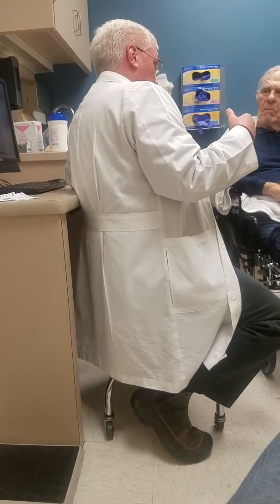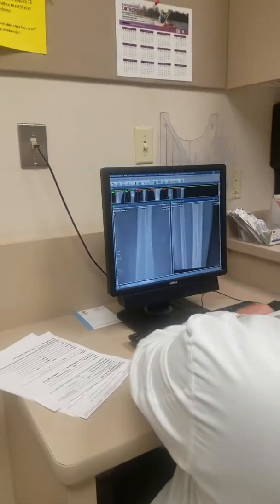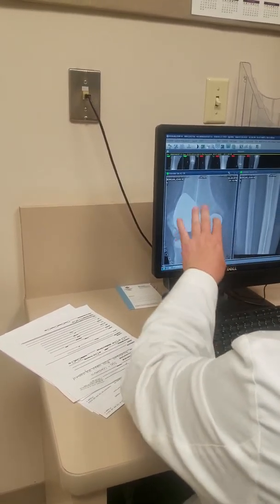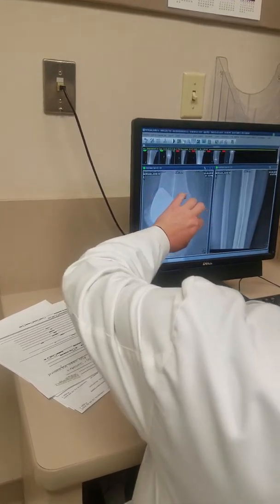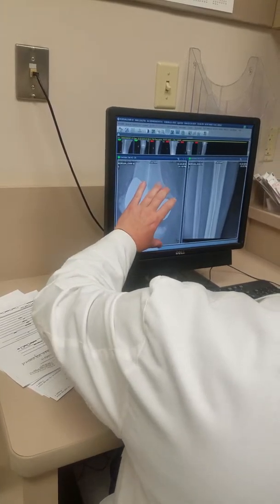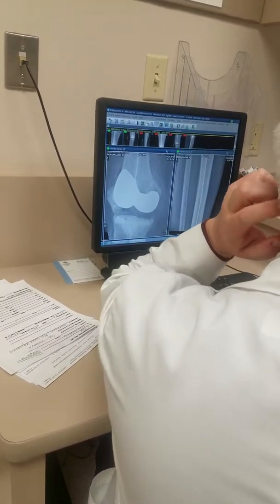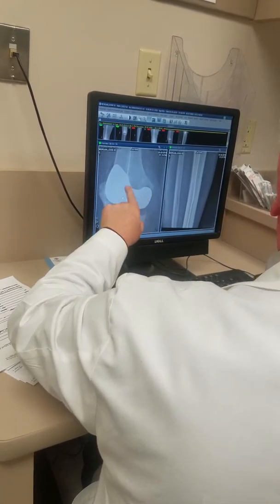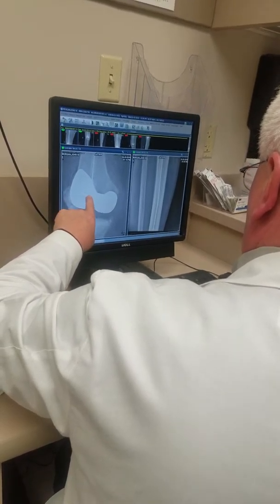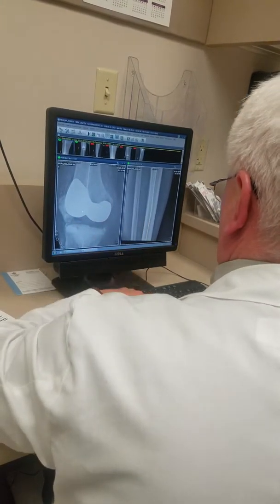So let's go through the rest of it. There's the wire. When we go to take that out, we just pull the wire and all the cement comes with it. Down here you have an older model, cheaper knee replacement piece that's just there to help maintain your joint space so the joints aren't sitting side by side. It's like a generic low-end piece because we're going to throw this one away when we put the real knee back in.